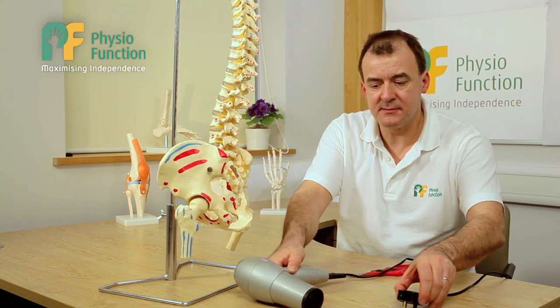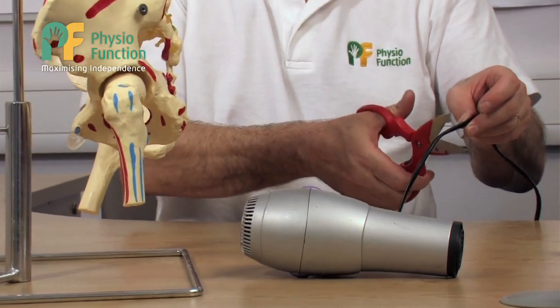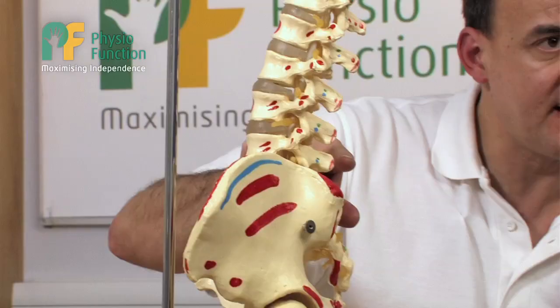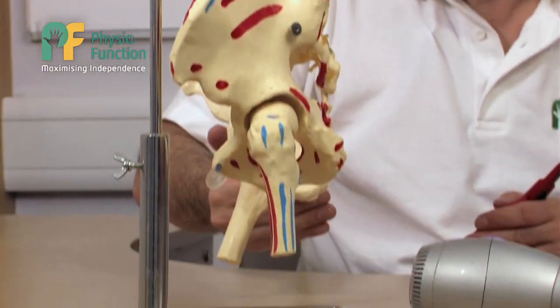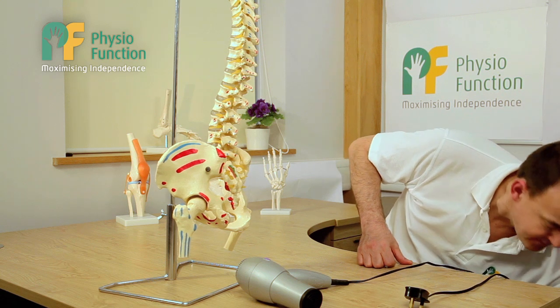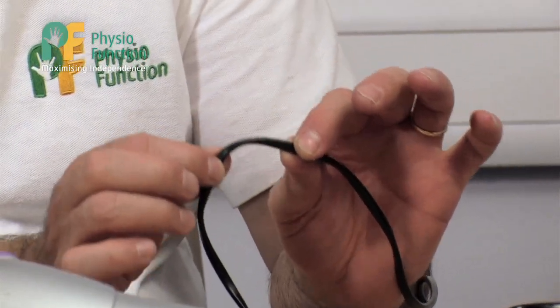Now, let's suppose that we cut the cable. It doesn't matter where I plug this device in, it's not going to work. And this is the same as if we have damage down this area in the spine or down in the nerves in the hip and lower leg. So we find that the alternative power source provided by the FES will not allow you to lift the foot up at the ankle.